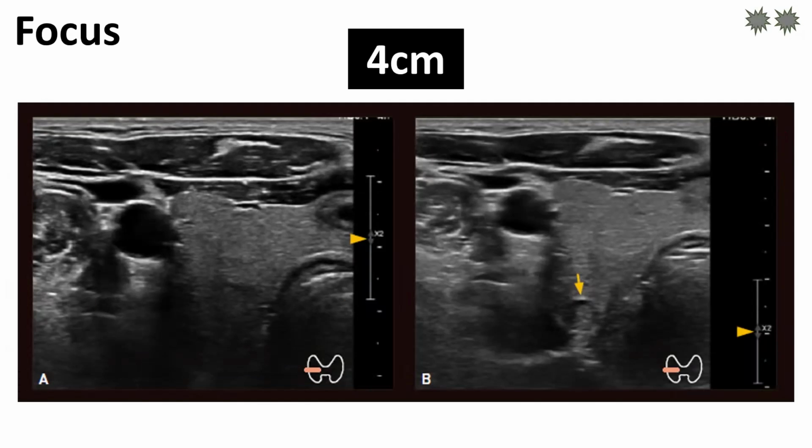This patient has a fairly thick neck. When you compare the image on the left and right, there are two big differences. First, the degree of pressure is different. In the image on the right, you can see that the thickness of the SCM muscle is thinner than on the left. So you guess that the right image was taken with more pressure on it. Second, the location of the focus is different. There is a nodule near the back of the thyroid gland. If you place the focus in the area where the lesion is as shown in the image on the right, it is more clearly seen.